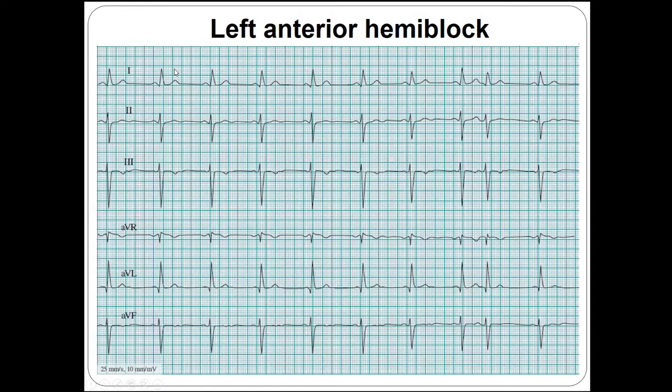Rhythmic, sinus, rate: 1, 2, 3, 4. It's about, let's see, for example, 65, good. P wave, yes. PR normal. QRS, well, it's borderline, 0.1 second, good. Axis: lead 1 positive, aVF negative, lead number 2 negative, extreme left deviation. So that's a left anterior hemiblock. It's not rhythmic right here. As you see, right away we do have an atrial premature contraction here, because we have a P wave here. We don't see the P wave right here, but here I do see the P wave.